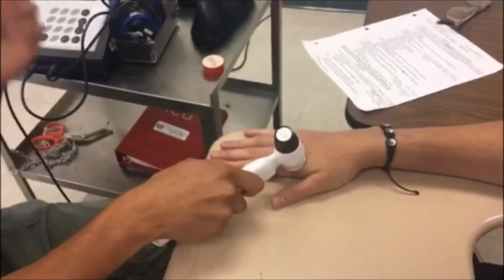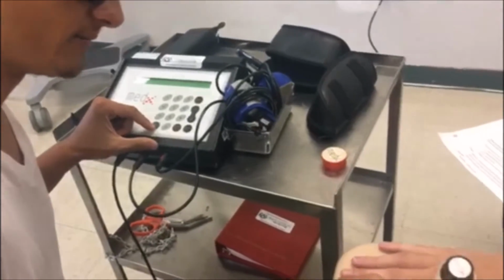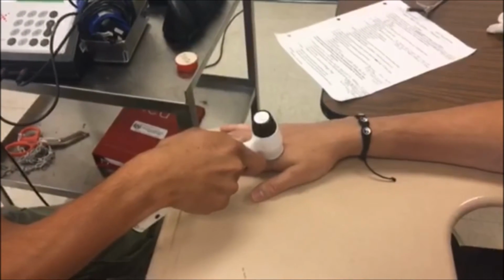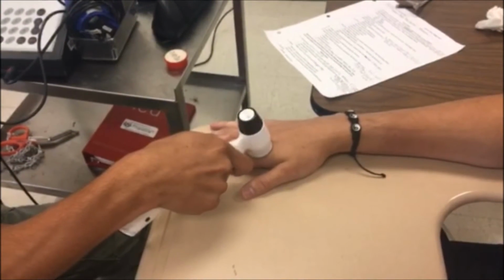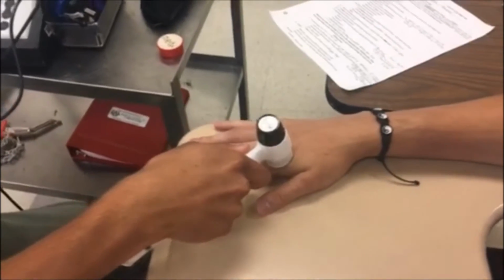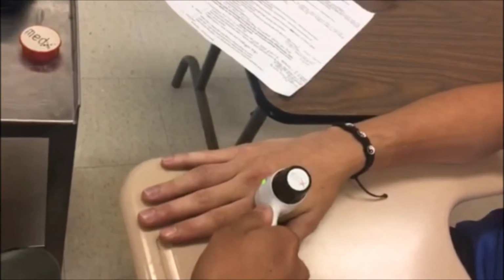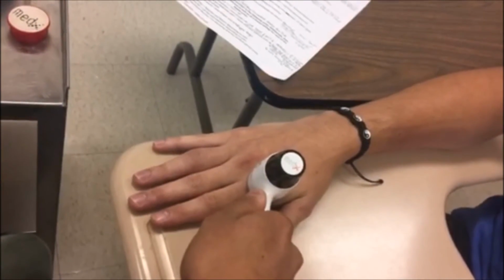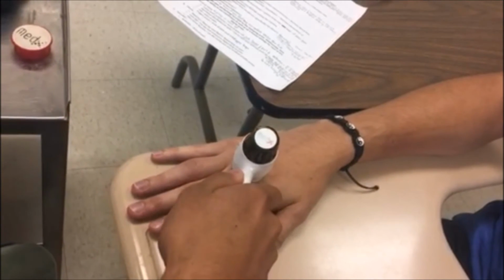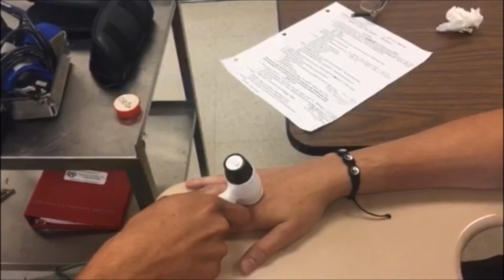I'm going to be doing the MCP joint, and I will press start. Once you press start, it counts down, and I'm going to press the trigger, and now the treatment has begun. The green light is on to let you know that it's giving the treatment. Okay, so the light is off. Now I can remove the laser, and I'm going to be placing it on the other joint. Now I'm going to press the trigger, and the treatment will continue for this one.